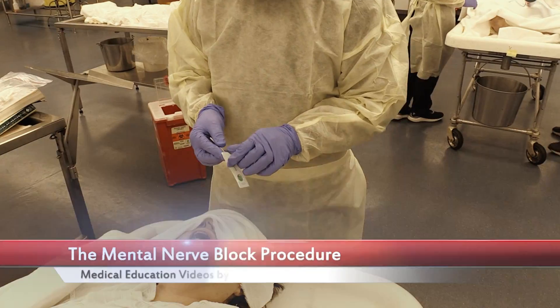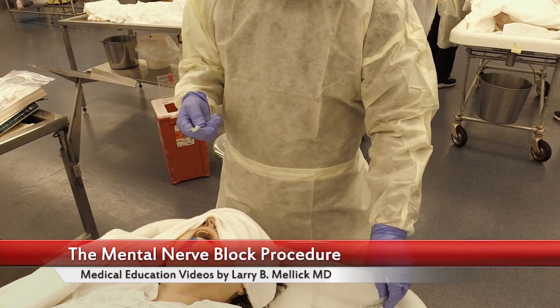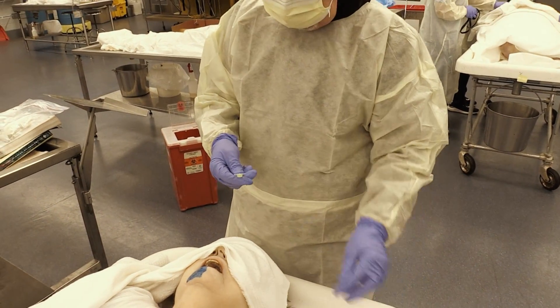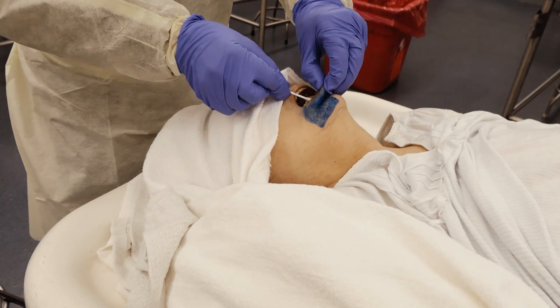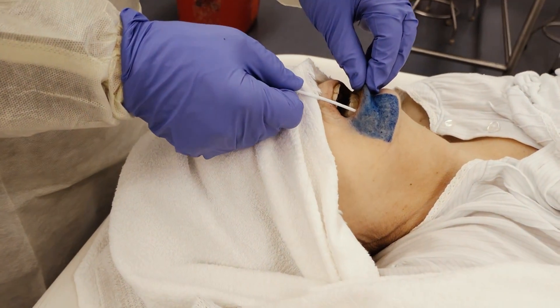The mental nerve actually lines up with the first premolar — you can actually palpate it. What I like to do is apply some topical anesthesia, like some lidocaine or something similar. Then you pull the lip up and slide it down right to the location of where you're going to do your mental nerve block.